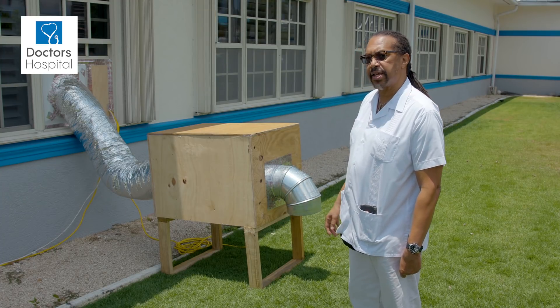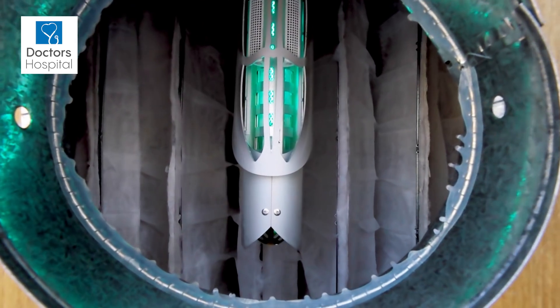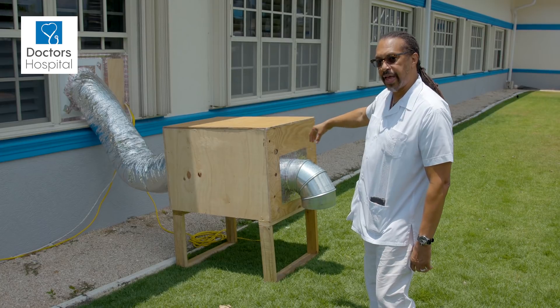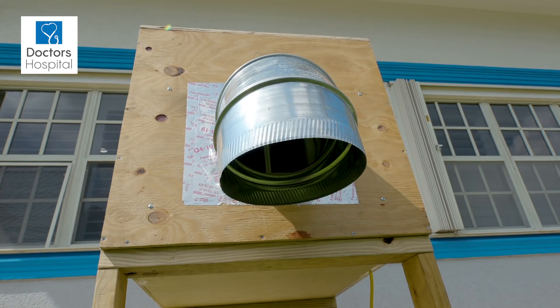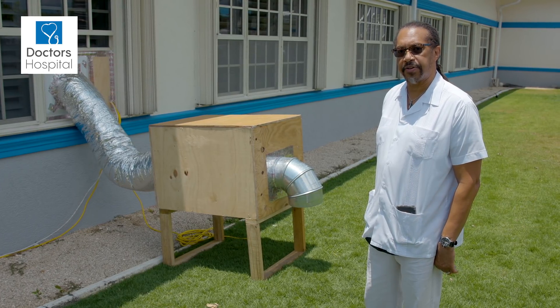The box also contains an ultraviolet light device that kills the germs, and then filters the germs with a filter just beyond that, so that by the time the air escapes, it's free from any bacteria or viruses.